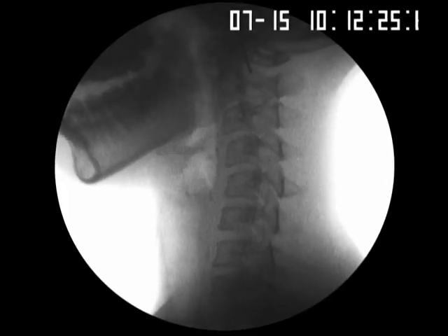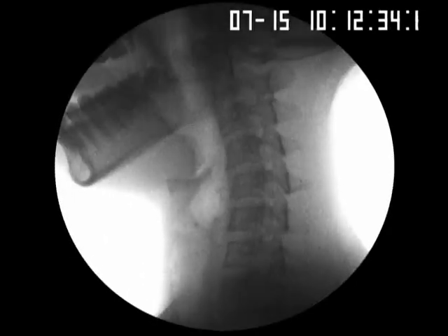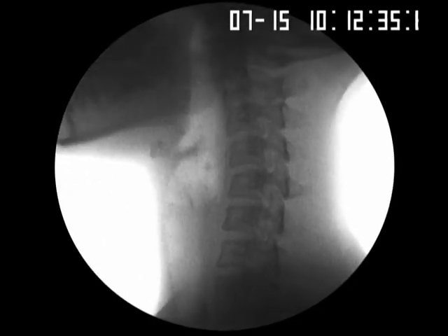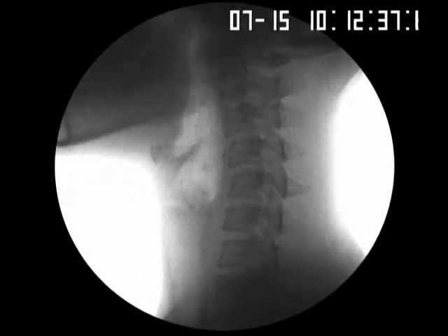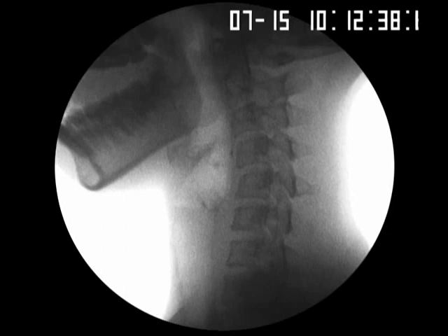Okay, do you feel like everything's going down or do you feel it stuck? Where is it stuck? Can you point to it? Right there. Okay, can you point again? Okay, can you turn around and put your back to the table? Other way. Yeah, let me have that spoon from me.